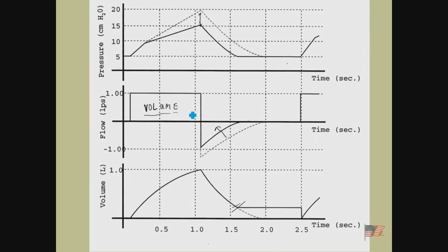Remember, everything on the ventilator is delivering, so this portion of it is all based upon the vent. A couple of things you notice is that the airway pressure is less than I expect, so something's causing it to not generate as high a pressure. Well, it could just be the compliance improved, or the resistance got less. Those would cause less pressure than you would expect.